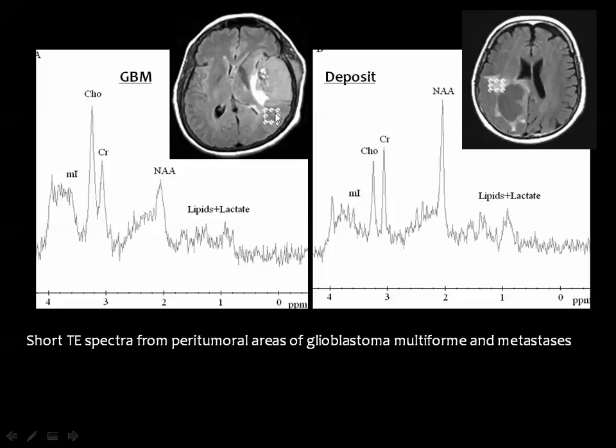the voxel near the edge of the tumor, outside the edge you see on MRI, and in the sample this area. If you got tumor spectrum, meaning that you got decrease in NAA and the elevation of the choline and some of the lipids and lactate, then you know that this lesion is glioma, because you know that the glioma edge is not indicated by any kind of imaging.